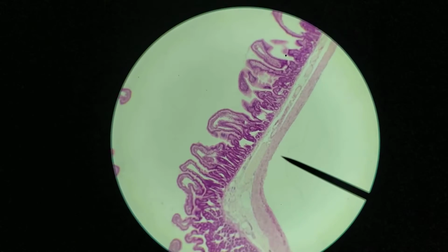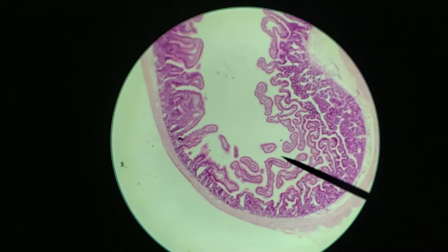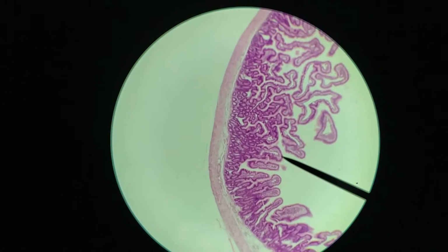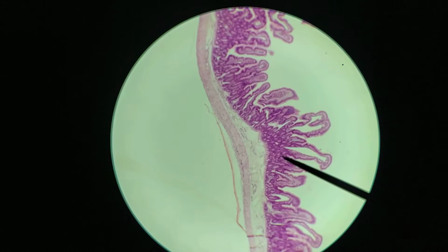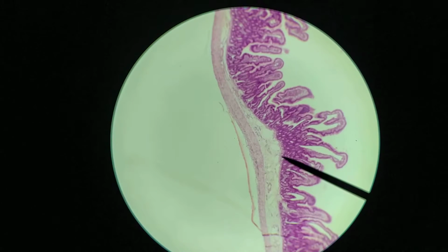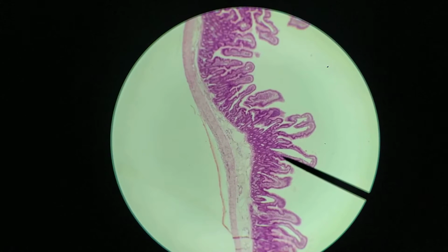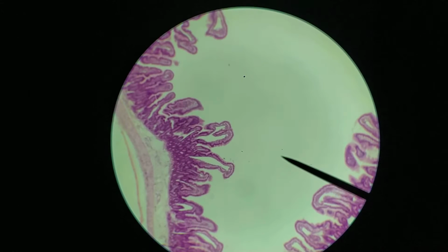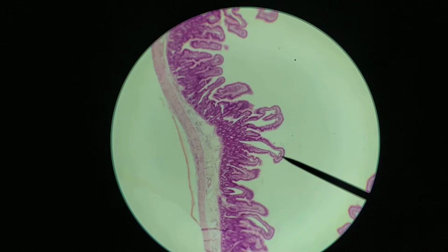Now, the way that you know that you're looking at the jejunum here, is that there's nothing going on here. The tunica submucosa has no features. There's nothing in particular that will tell you that you're looking at anything specific. This whole structure is really just focused on just absorbing nutrients from the lumen. Okay, so we're just seeing a lot of very elaborate villi, and that's about it.